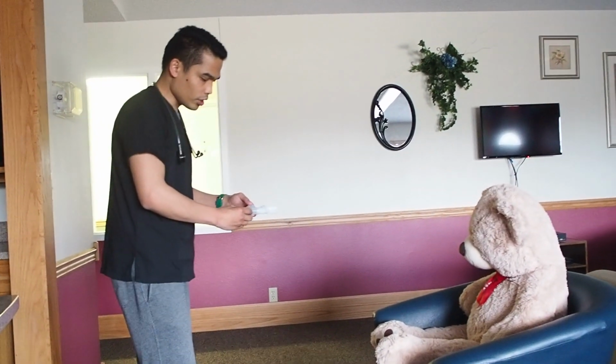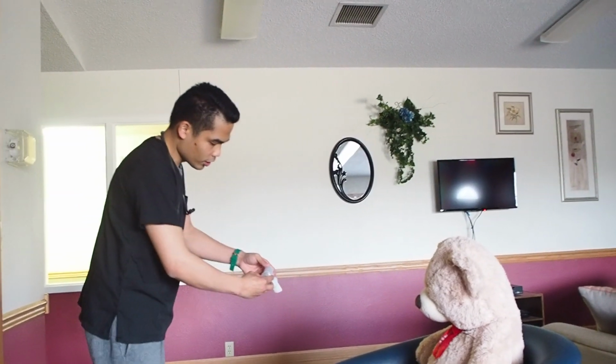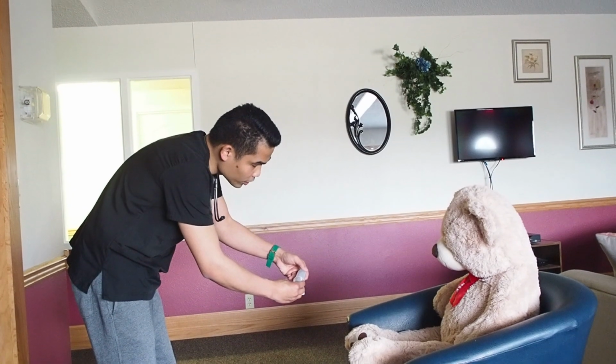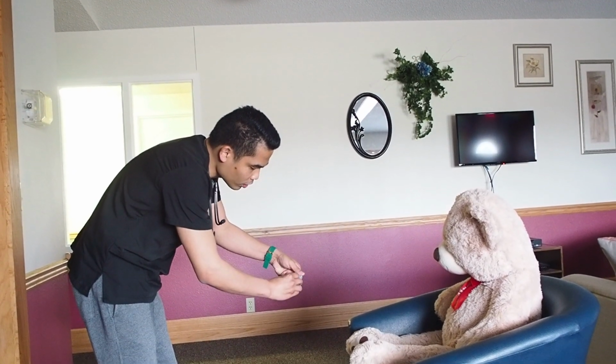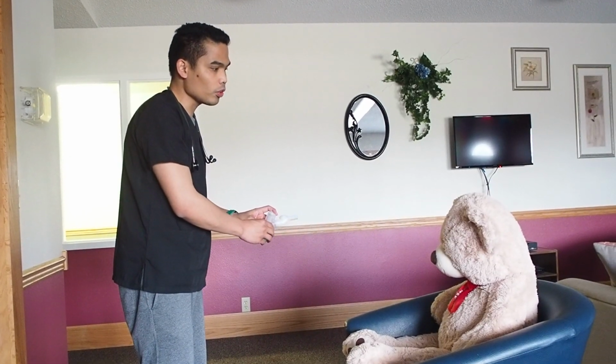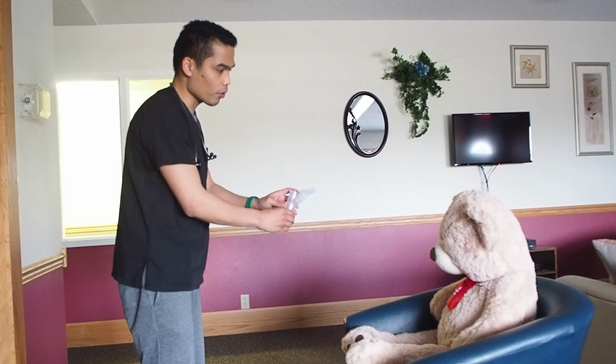All you have to do, I'm going to demonstrate it, is twist this until you hear a click sound, and that means it is ready for use. Prior to putting it inside your mouth, you have to exhale all your air out away from the device.